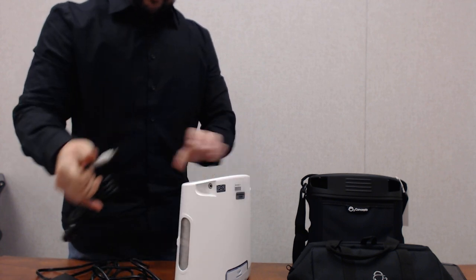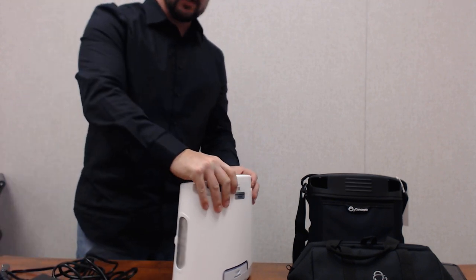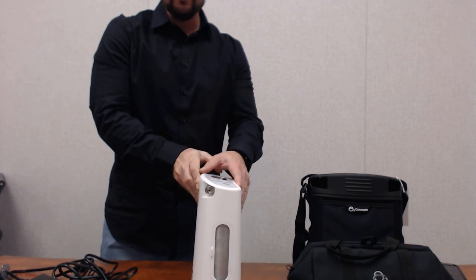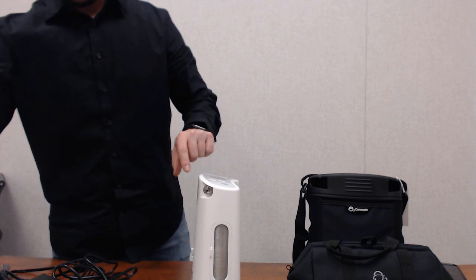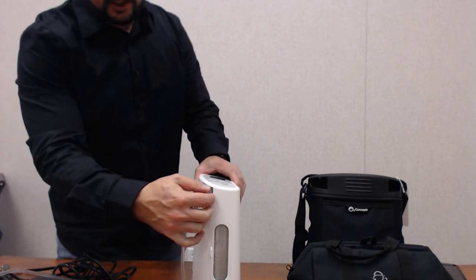On the opposite side from your charging port is where you connect your nasal cannula. You have a metal port right here which your nasal cannula tubing just slides right over top.